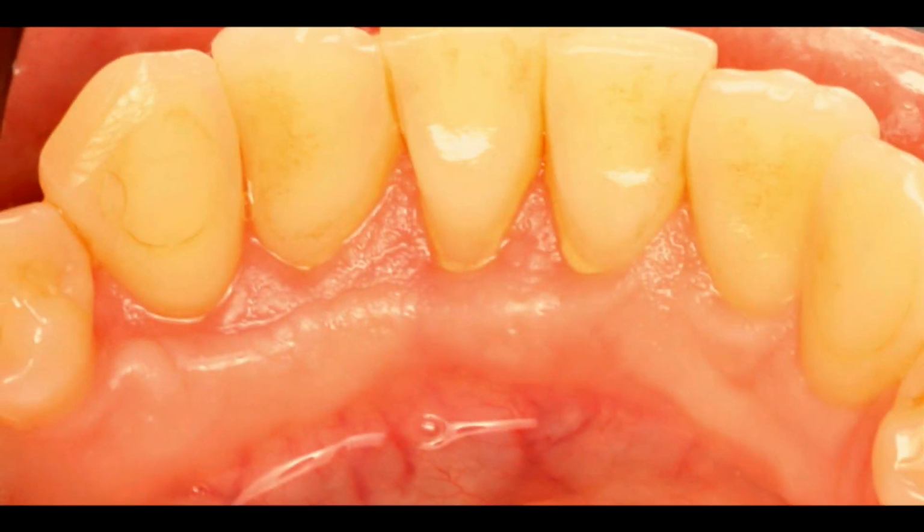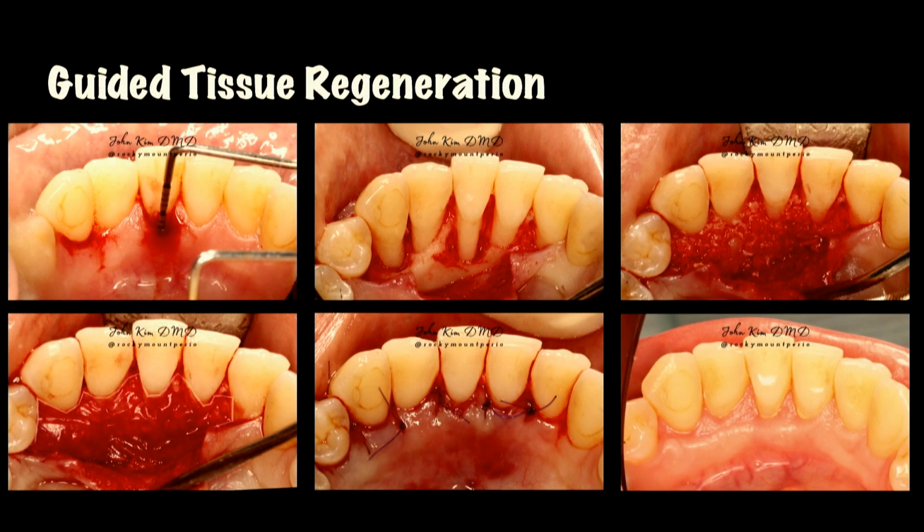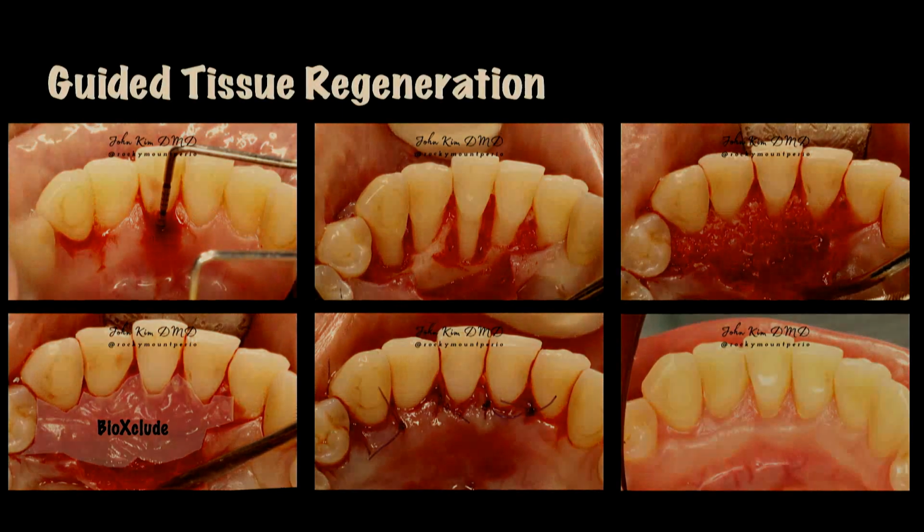Now look at this here, and when I look at this, I forgot that I did a flap surgery with GTR here. It almost looks like I did a free gingival graft case here, but many of us probably do not like doing FGGs in the lingual of the anterior mandible. With flap reflection, you can see there are multiple defects here showing the bone loss, and do everything the way you normally would do. Okay, and get that bone graft in place, and you can see the outline on the lower left of where I have the BioXclude, and get that tension-free primary closure and subsequent good healing.